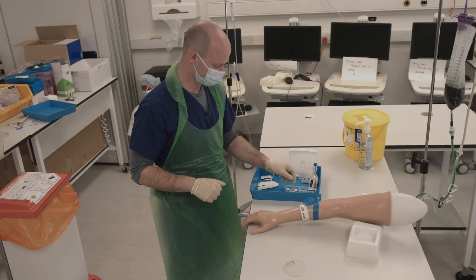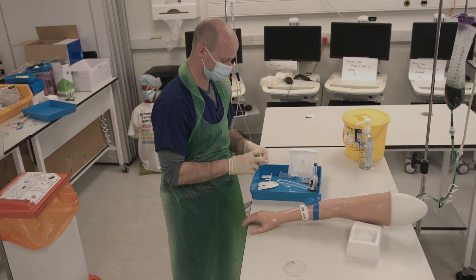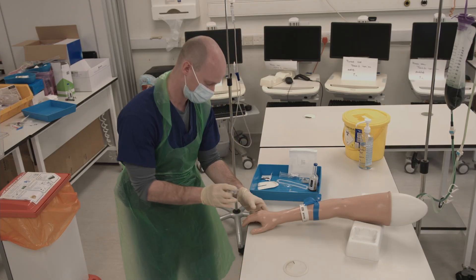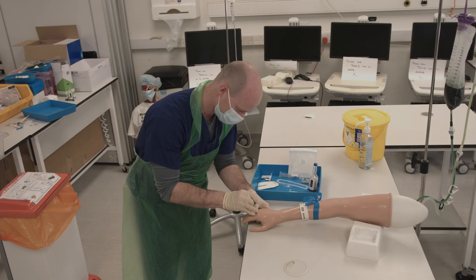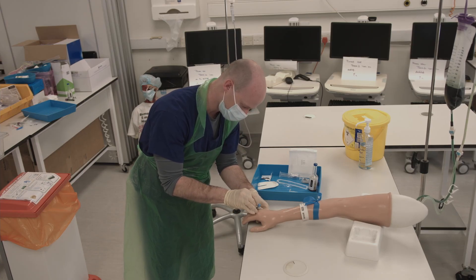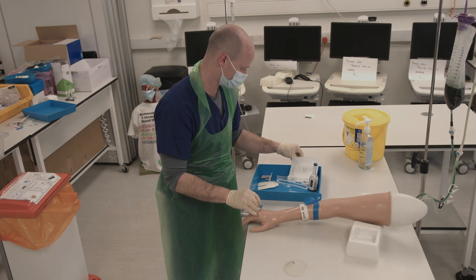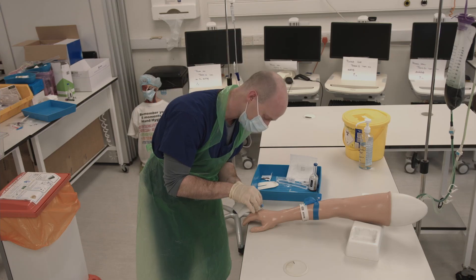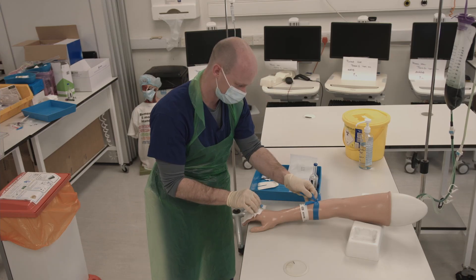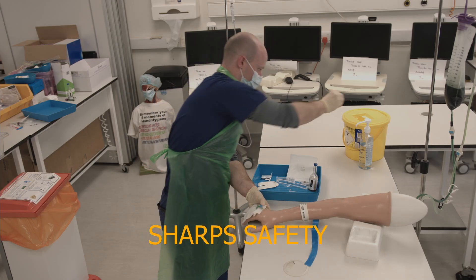Prepare your cannula. Anchor the skin and advance the cannula until you see primary flashback. Then retract the needle slightly and advance the cannula fully into the vein. Place your gauze, undo the tourniquet, and remove the cannula needle, discarding immediately into a sharps bin.